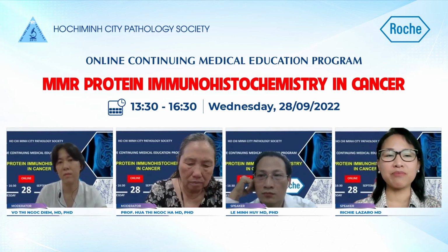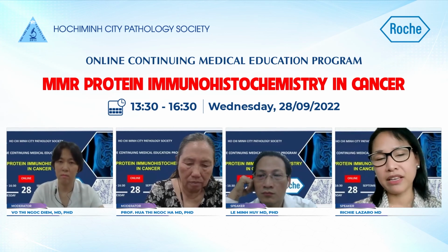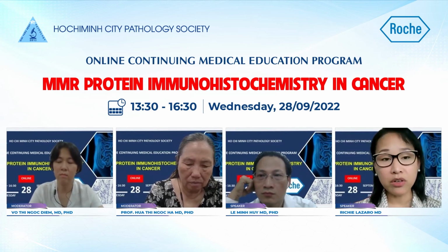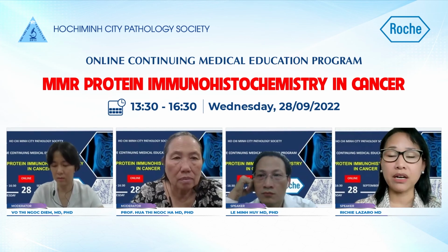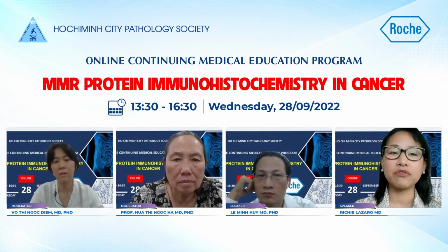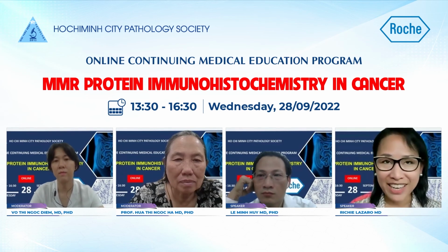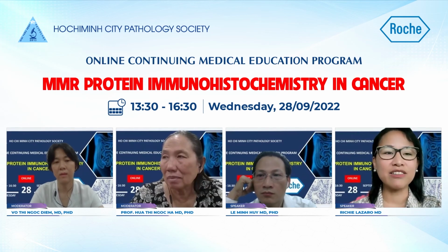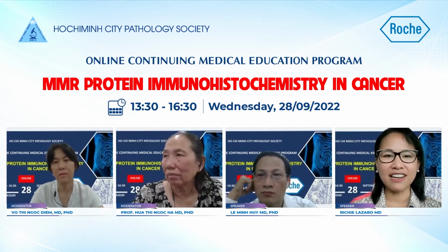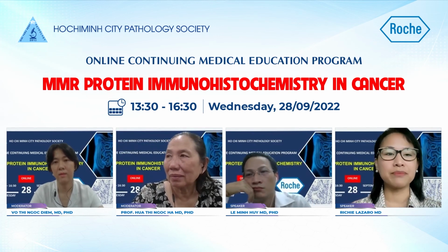Because if it's very weak, like in the example I gave in my lecture, and it's focal, for example, in the tumor cells compared to the internal control, chances are it will be interpreted as a loss of protein expression. But again, I always say, just be careful when it comes to interpreting MMR, when it comes to staining that's not so straightforward.